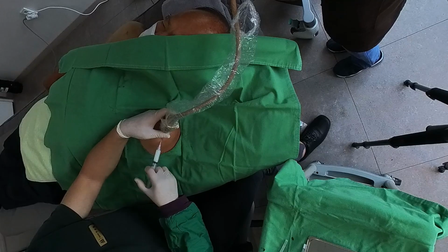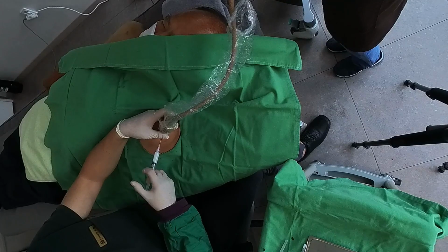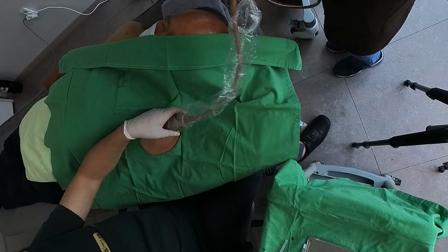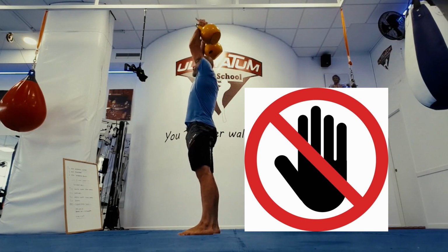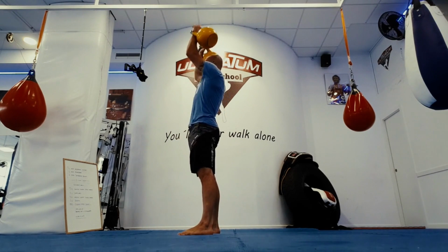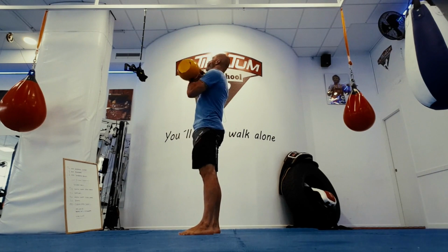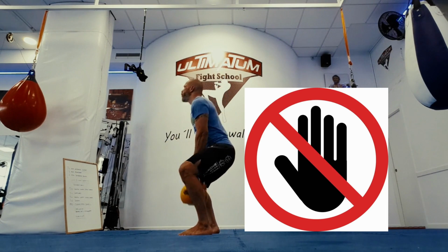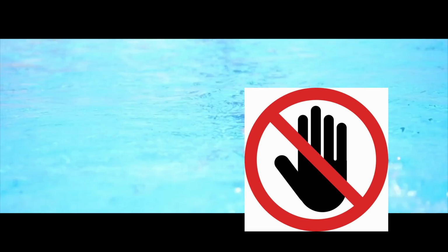Post-lavage injection. After successful aspiration, slowly withdraw the needle to the subacromial bursa and inject a mixture of 1 ml 2% lidocaine and 1 ml of dexamethasone into the subdeltoid bursal space to reduce inflammation and risk of post-procedure bursitis. Post-procedure care. Activity restriction. The patient should avoid heavy lifting and overhead movements for approximately 2 weeks to ensure the treated area remains undisturbed. Pain management. Apply a cold compress to the shoulder to alleviate pain. Prescribe a combination of acetaminophen and nonsteroidal anti-inflammatory drugs, NSAIDs, for pain relief.